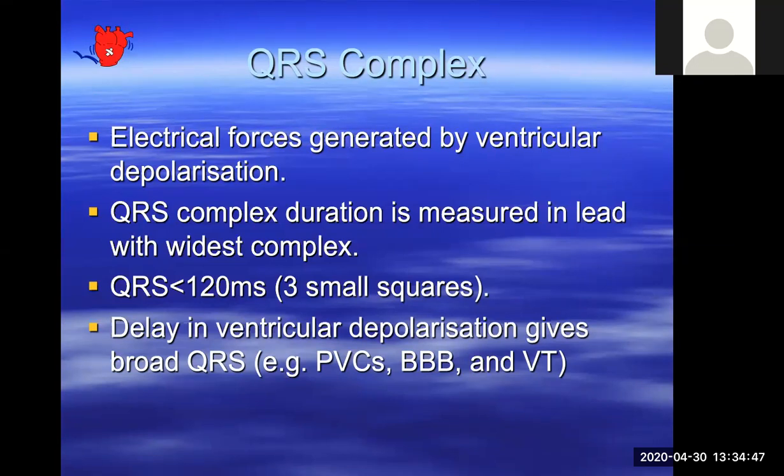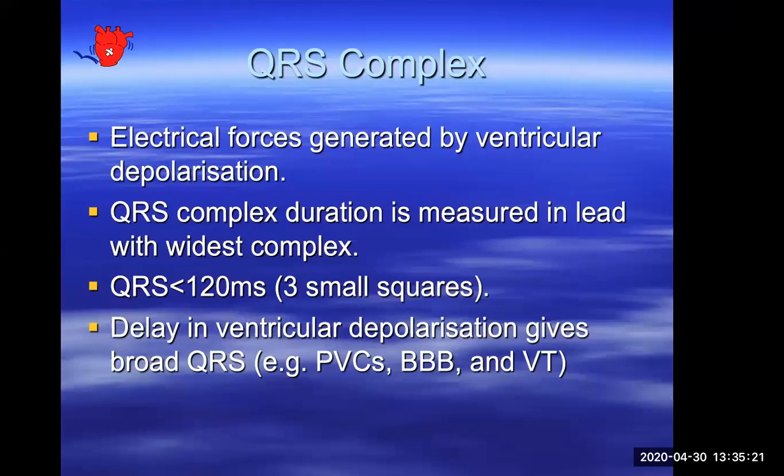wide becomes wide, as I said to you before, the electricity in the ventricle has to go through its wire, through its Purkinje fibers and the bundle of His, because that's the electrical wire, fast conduction. If one of those bundles is blocked, then the electricity has to go through the myocardium, causing delay and widening of the QRS complex. And the same if you've got an ectopic coming from the ventricle, premature beats, it goes through the myocardium, because it's coming from the myocardium. That's why it produces a wider QRS than a normal beat coming from the atrium.